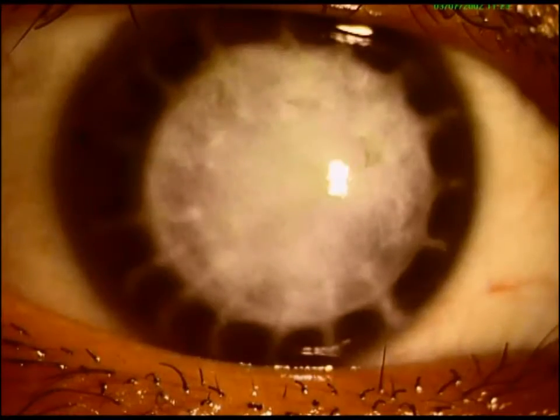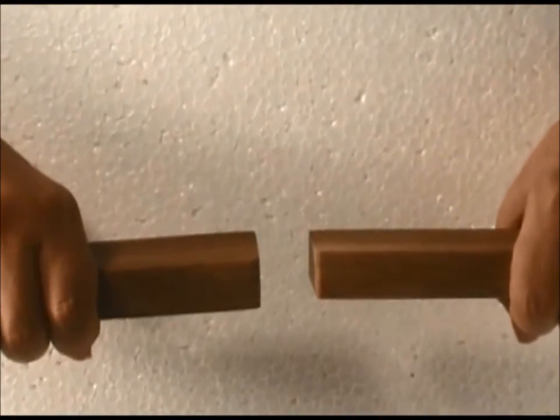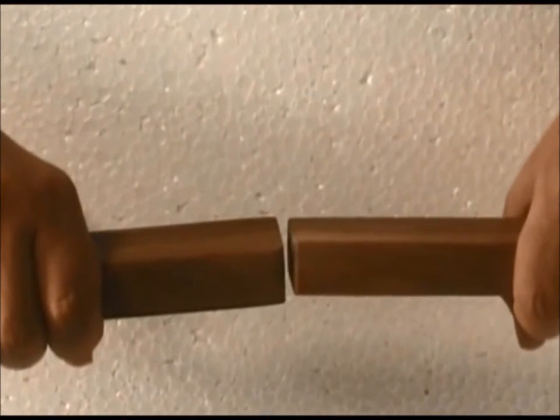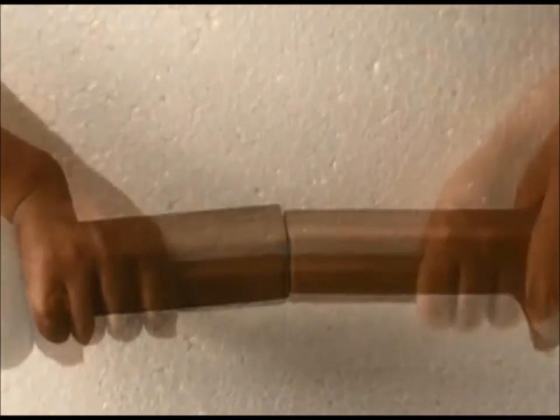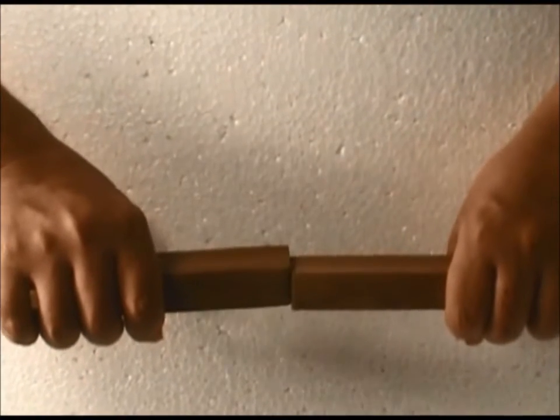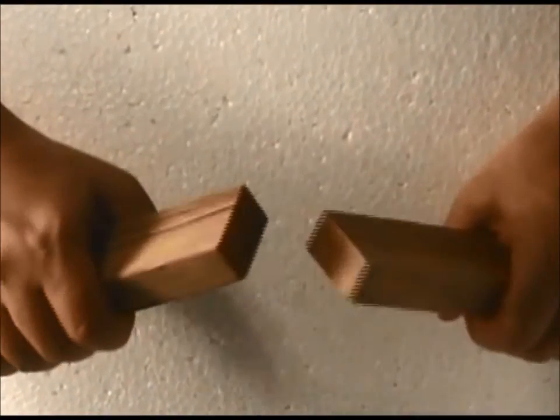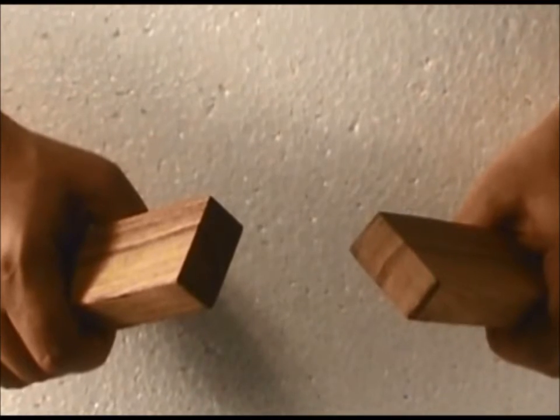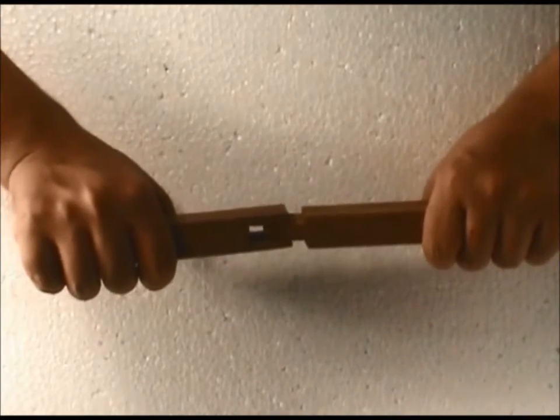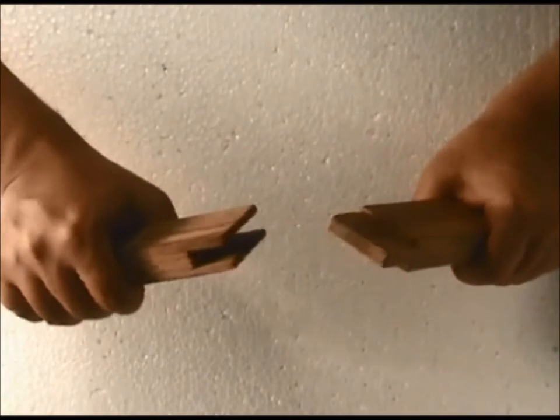When the corneal button is sutured to the host cornea, this is the configuration of the host-graft junction that is achieved. As we can see, this is not likely to be very secure, as the opposing areas are actually thin edges. What if we could change the wound configuration?